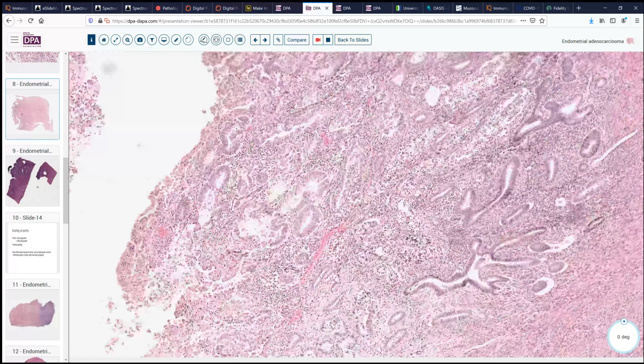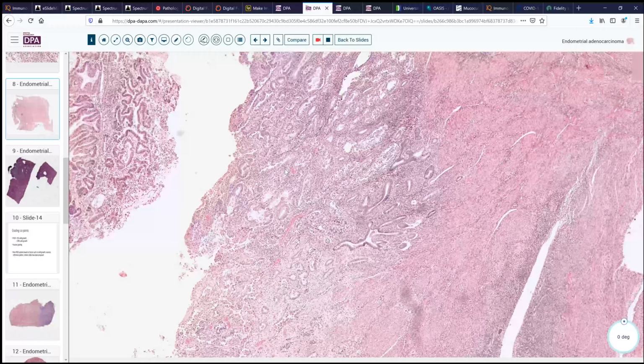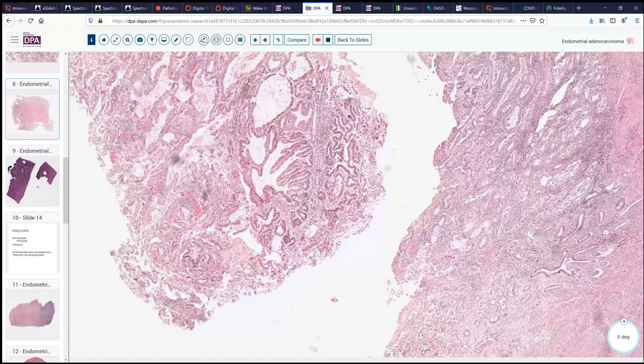And as you can see here, some of these glands are very difficult to distinguish from benign glands or neoplastic glands. Is it solid growth or is it discohesive glandular tissue? In many of these circumstances, you feel fortunate to be able to establish the diagnosis of cancer, let alone to be able to accurately grade it and stage the tumor for best therapeutic options. So make sure your procedures allow for correct fixation.